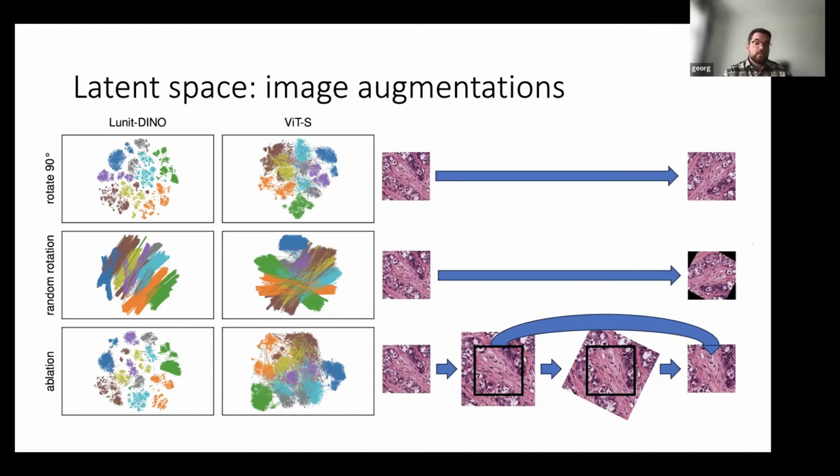Yeah, that is an important question, and there is some insight to be gained from that study on your particular question. So what we find is, we looked at 10 feature extractors, and those that perform specific augmentations that are relevant to pathology tend to perform better in terms of the downstream performance. Not only in terms of looking at the latent space, but also the downstream performance.